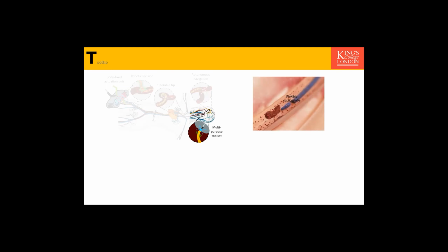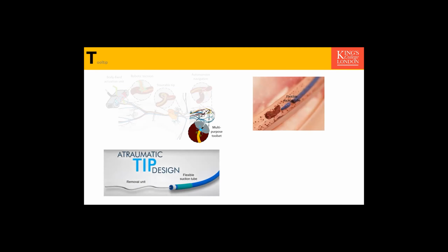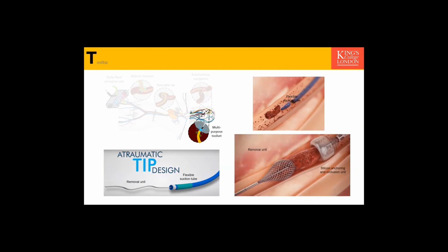for the needle. So the standard tools being used for thrombectomy and clot removal basically use suction to remove the blood clot, using guide wires to drill through the clot and then suck the debris, or a better solution, probably using a combination of blocking the blood vessel and collecting the blood clot so the residue doesn't propagate through the rest of the blood vessels, blocking the smaller veins further forward.